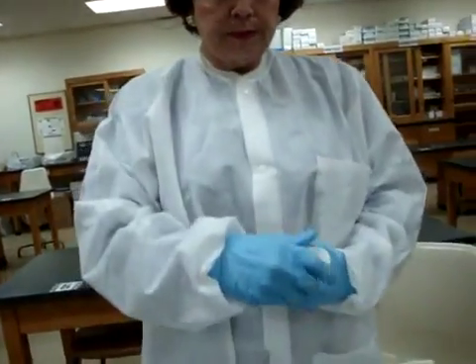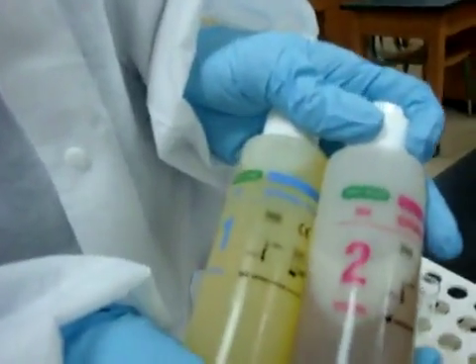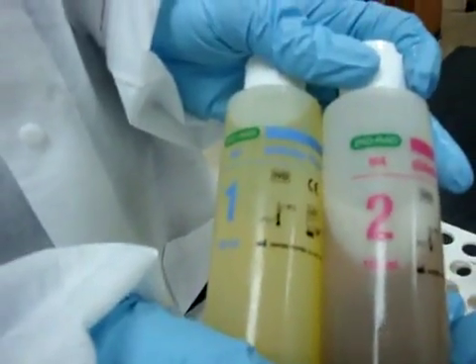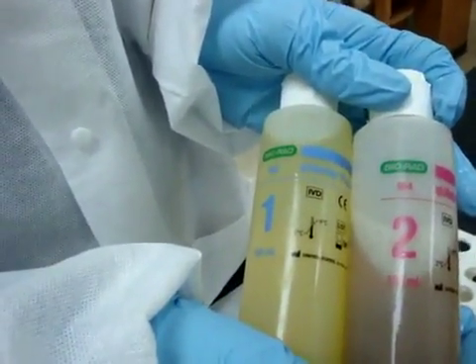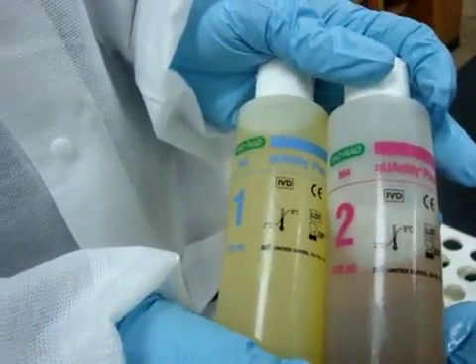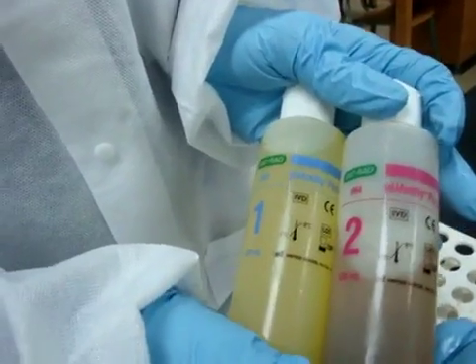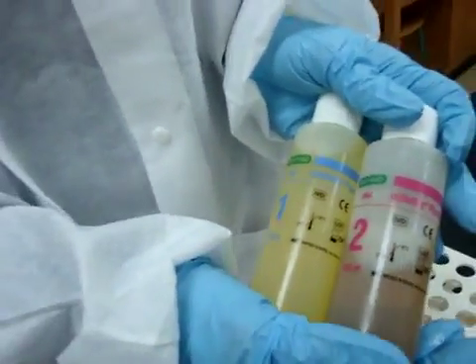They will record the results and put them up front on the desk for the other students to look at and to record. We have here two controls, a quality control 1 and a quality control 2. 1 is for normal urine, negative, and 2 is for positive. So we want to check both the positive and the negative results for our dipsticks.